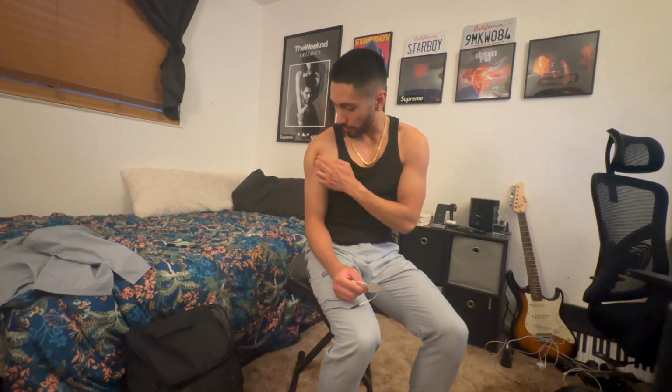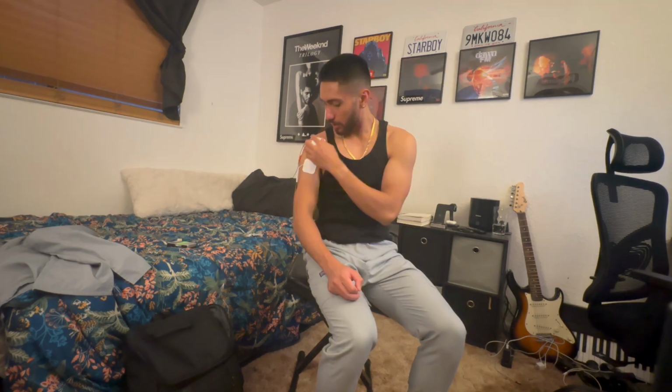For pad placement, we'll go ahead and centralize the treatment area. So if my pain is right here, I'll place the pad right above and right below it. So then the treatment area is in the center of the pads. So right there, it's right on my deltoid. So we can treat this area where I'm feeling the most shoulder pain, typically whenever I'm doing movements.